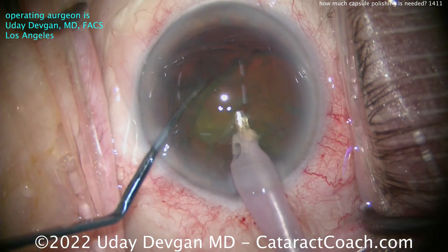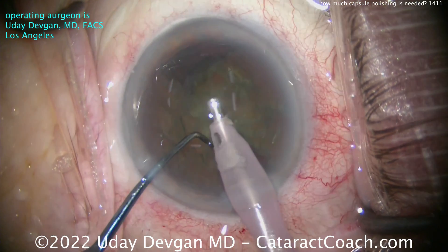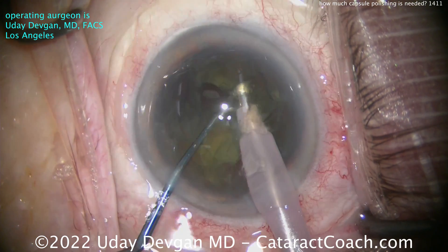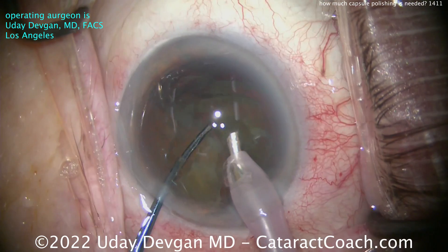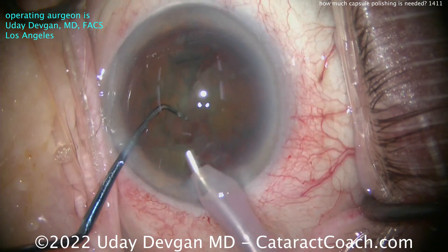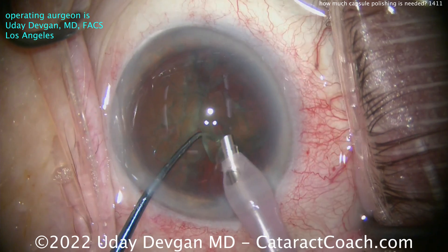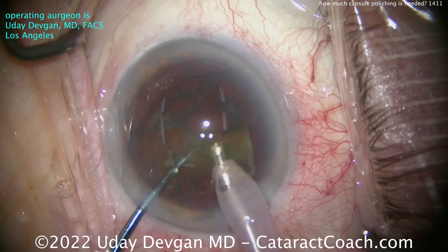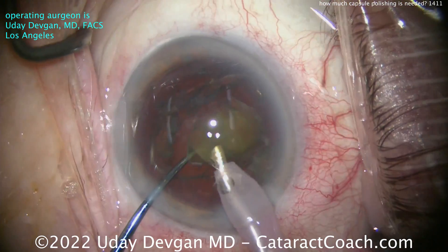This part of the surgery is going to be routine, but what I want to think about is how much capsule polishing do we do. You've seen videos of other surgeons on Cataract Coach who use dedicated capsule polishing instrumentation — after nucleus removal, when the capsule bag is full of viscoelastic, they use those instruments to really scrub and polish the capsule bag, especially the undersurface of the anterior rim. I tend to do capsule polishing using the IA probe because it has vacuum built right in, so we can remove a lot of those lens epithelial cells. But what's the balance?